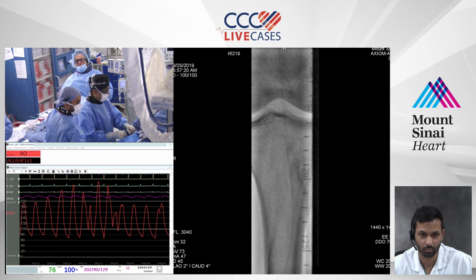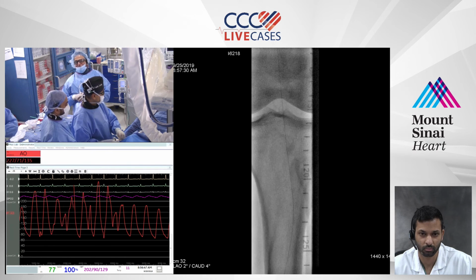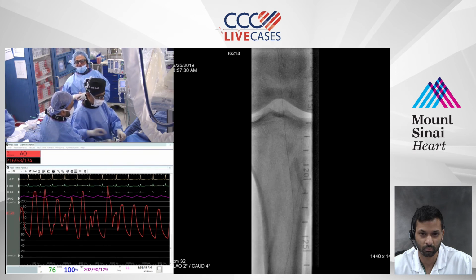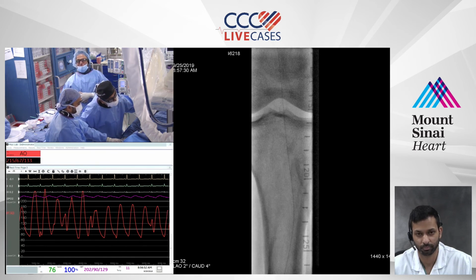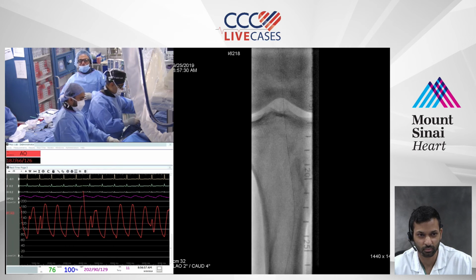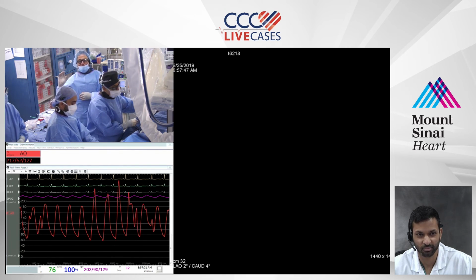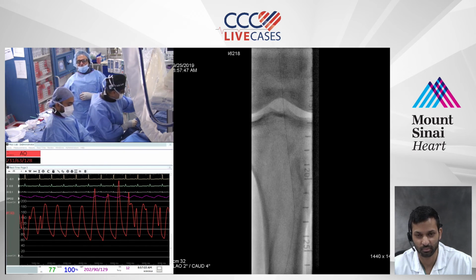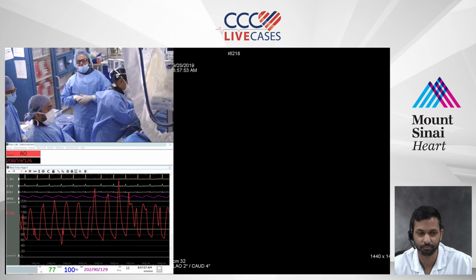While in a bypass, absolutely you should, to save the graft, I don't necessarily think that's true in an endovascular case. But the problem is we don't have any objective evidence saying, okay, this PSVR, the patient is symptomatic and we should do it. We don't think like that. We have a knee jerk. Oh my God, it's a doubling of the PSVR. The guy's getting a restenosis. I have to do it. Well, it's a totally different natural history of our intervention versus a bypass.